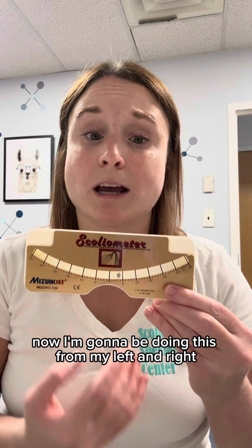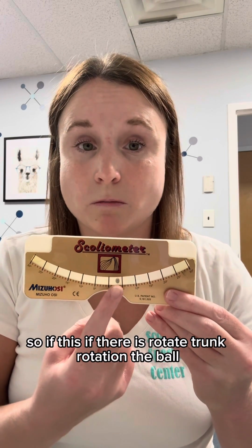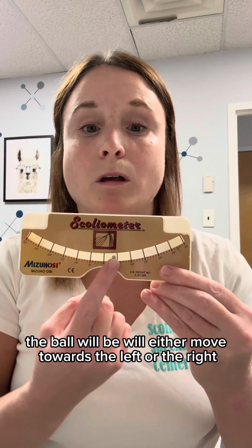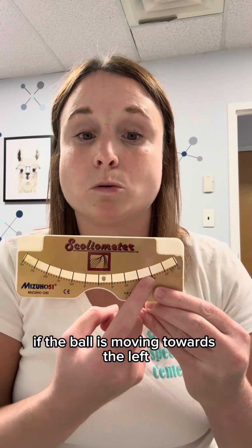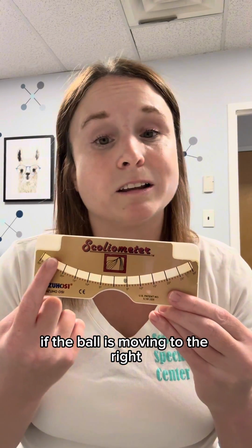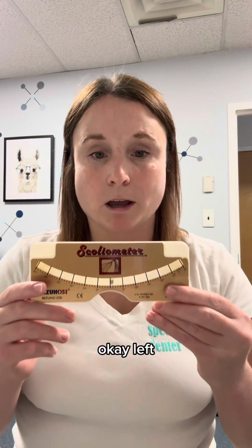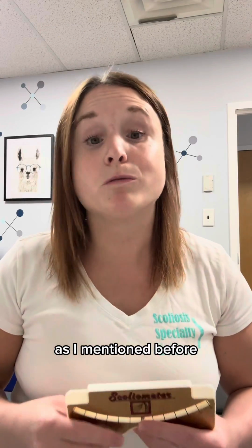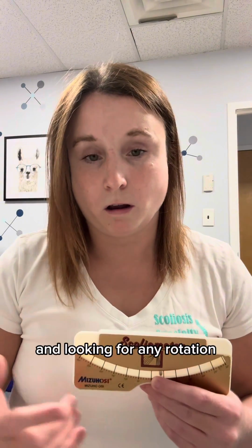Now I'm going to be doing this from my left and right. So if there is trunk rotation, the ball will either move towards the left or the right. If the ball is moving towards the left, that means the rotation is to the right. If the ball is moving to the right, that means the rotation is towards the left side. As I mentioned before, we're going to be running the scoliometer along the entire spine and looking for any rotation.